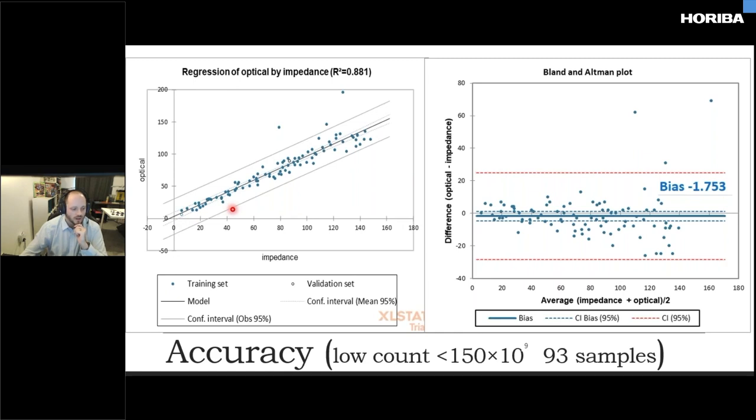The majority of samples ran correlated between both methodologies. We were very impressed at the tightness of the run between the two values. There were a few outliers, and I'll come back to discuss those at the end, because these are patients of interesting clinical significance, and the disease states in them could be supported through diagnosis via this methodology.